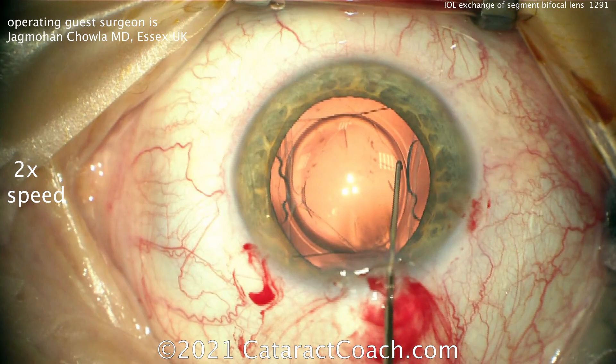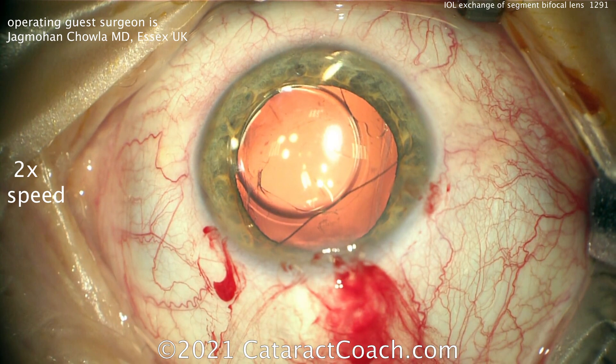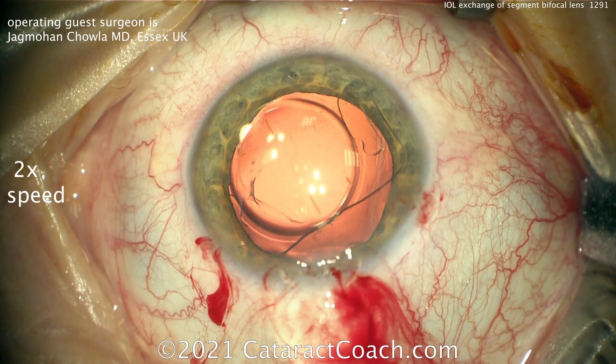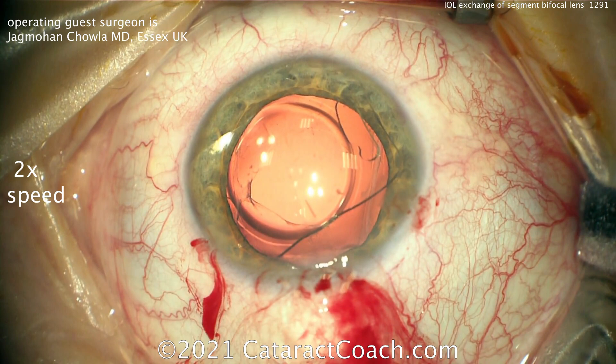Going to the other side — you can see that more than half of this video is the careful dissection of the lens out of the bag. Now the lens is well above the anterior capsule rim, even above the iris, and it's freed. The capsular bag can now be inflated a little more, and the new replacement IOL can be put in. Slight enlarging of the incision for the new lens insertion.